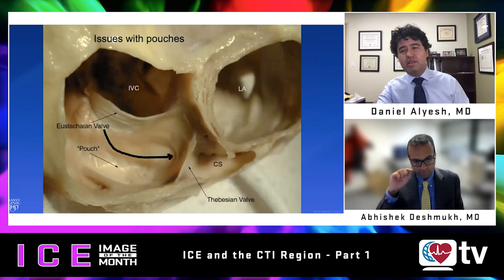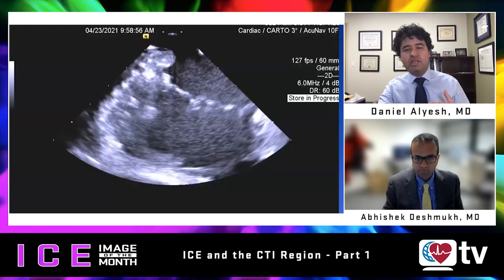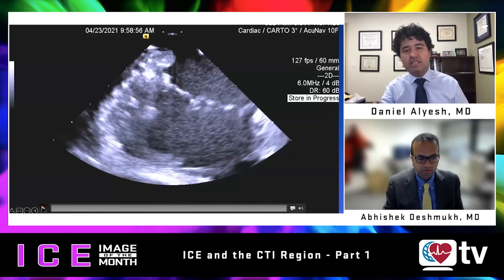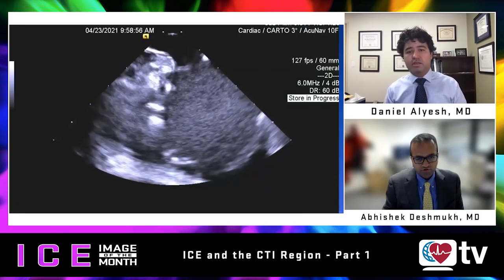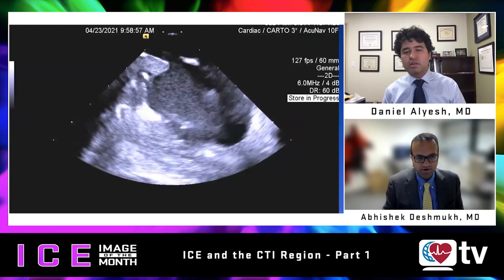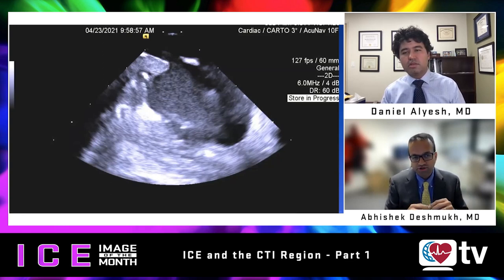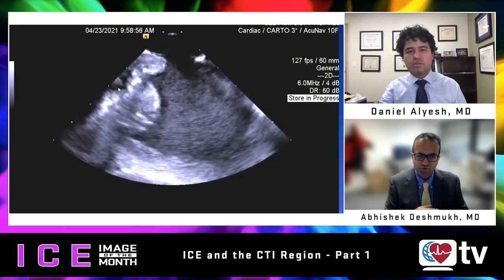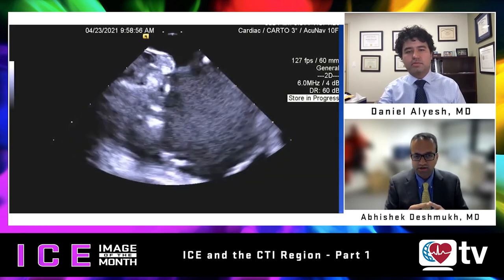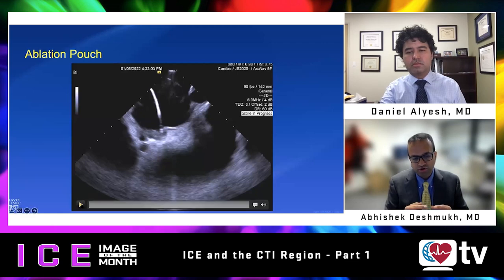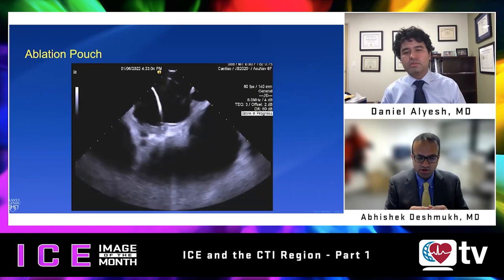Moving to the next topic: pouches and pectinate muscles impacting the CTI. As soon as the ICE catheter goes up and we see a complex CTI, we wonder how we are going to tackle it. You can see a very deep pouch in the middle of the cavotricuspid isthmus. There are two issues with pouches: ablation within the pouch, and if you're not using ICE, you could miss the pouch completely, ablating both proximal and distal to it. From an ablation standpoint, blood flow is slow in a pouch, so temperature and impedance rise, there is more risk of a steam pop, and the lesion will be smaller if you can't deliver good power.